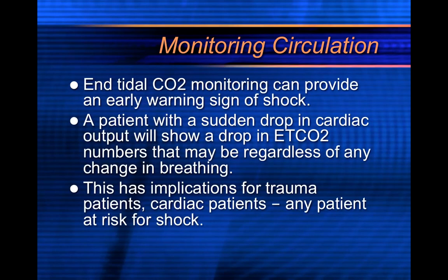End-tidal CO2 monitoring can provide an early warning sign of shock. All right, I've kind of spoken about that. If you suddenly get a decline in end-tidal CO2, your patient might be in shock. Also, let's say you run on a septic patient, somebody that's got a super high fever, or maybe they're hypothermic. Remember, septic patients can be hypothermic.